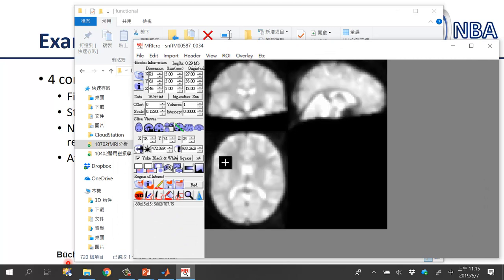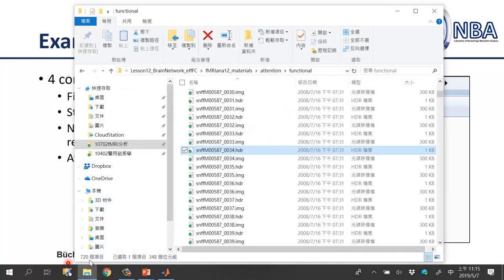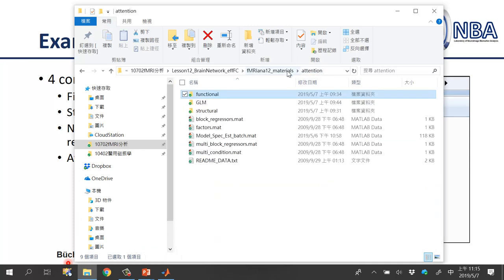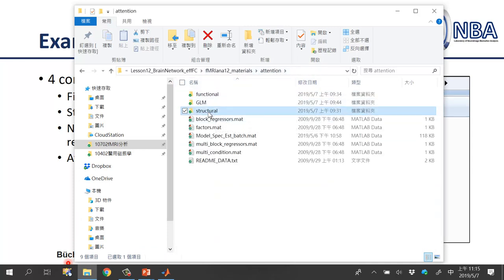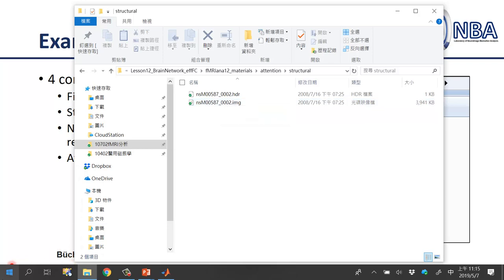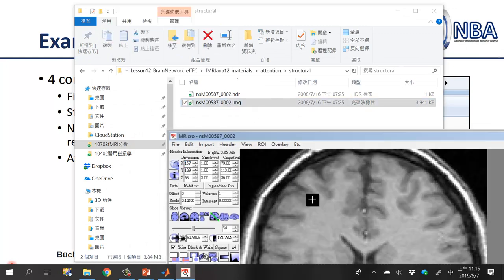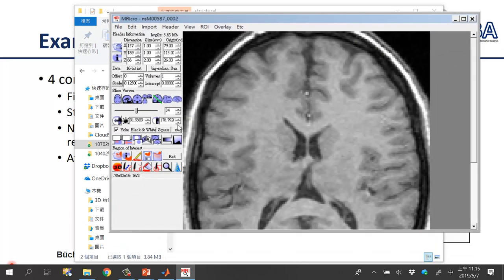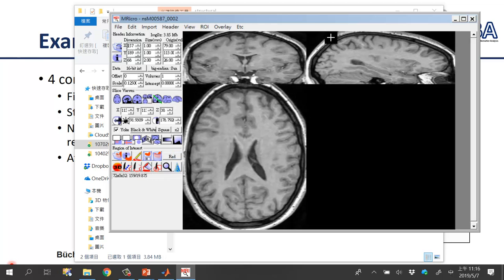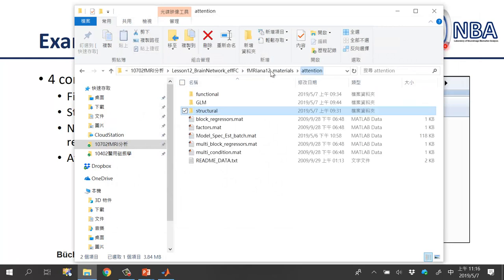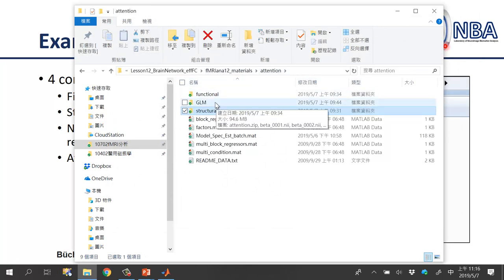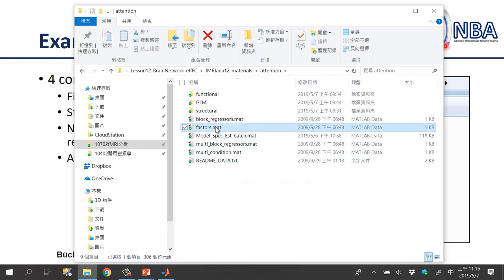This is the pre-processed image dataset provided by SPM. You can see they have 720 files, meaning the image file includes 360 different time points. For the other subfolder named 'structural', this is the normalized T1-weighted imaging. You can again use MRIcro to view the subject's normalized T1-weighted image. Beyond these two subfolders, you can also see there are several different mat files — one of these stores the onset times for different tasks.